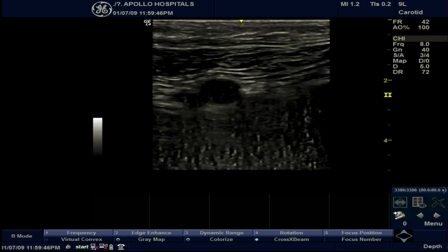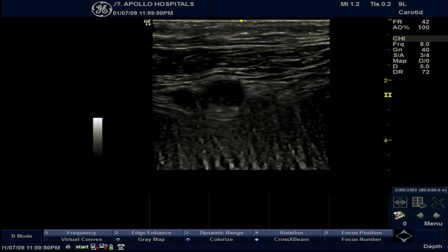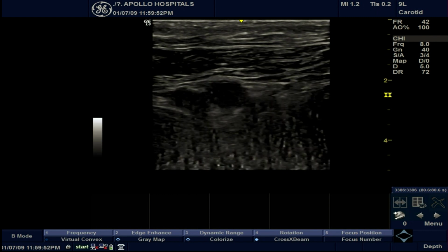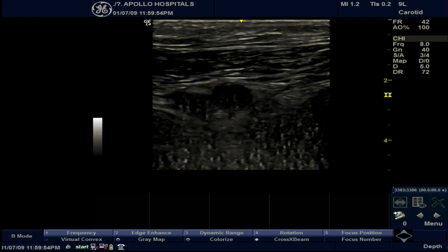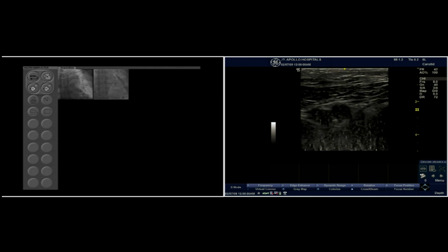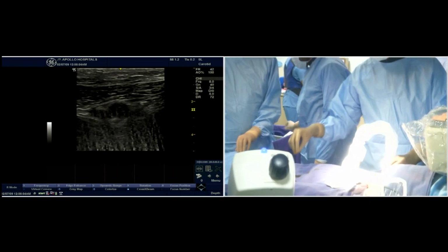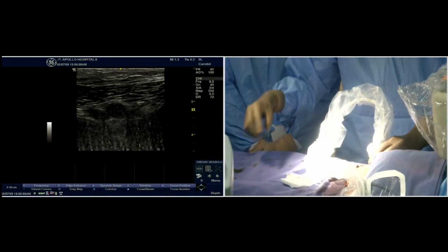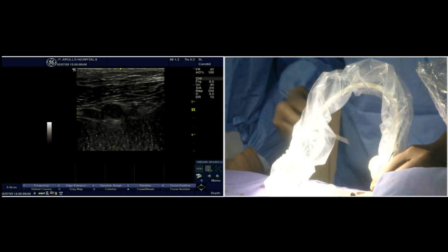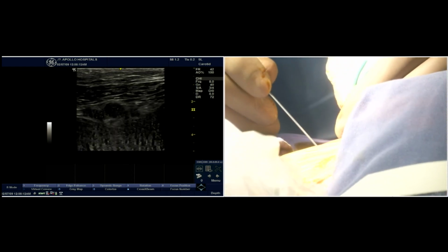You need to give, okay. Can you show your hands also? Can the camera show your hands? Can you show the camera down? We're only seeing the floor in that image, so we don't need to see the floor. We just need to see your hands. Can you focus the camera on the hands? Can you see it now? Yes, we can. Can you see the ultrasound also?